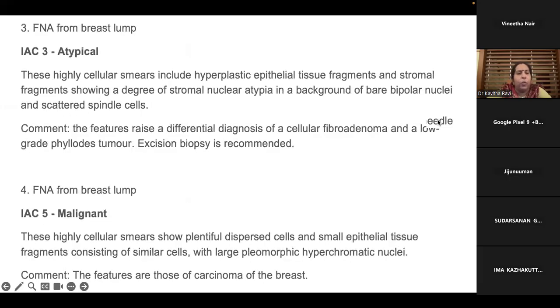of a fibroadenoma as a benign epithelial proliferative lesion. Atypical, that means the pathologist is not very sure whether it is an overt malignancy or it's benign. But it need not be benign, because only when we see some of the atypical findings, we commit on this atypical. So it's going to be a problem. As I just mentioned, follow up these patients and go for repeat FNAC. And again, the triple method is very, very important for breast lumps. And malignant, always, when we are 100% sure, we'll definitely give a diagnosis of carcinoma breast.